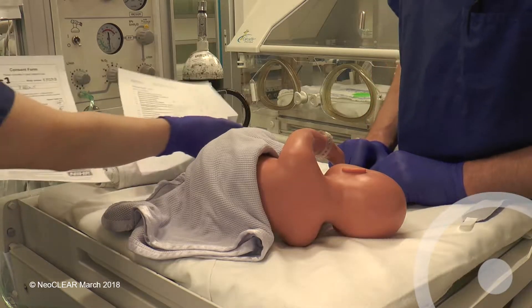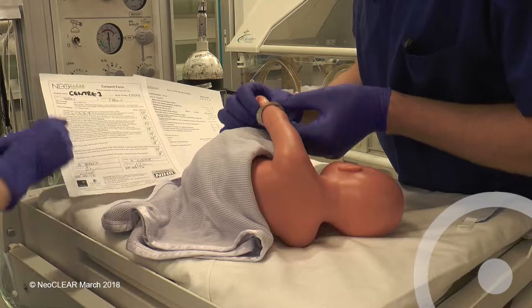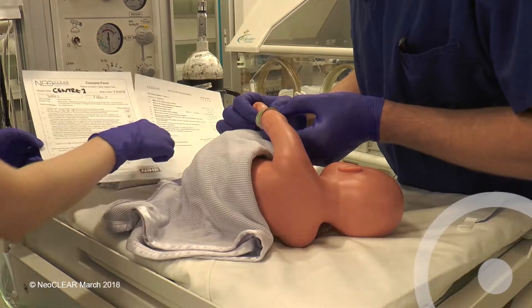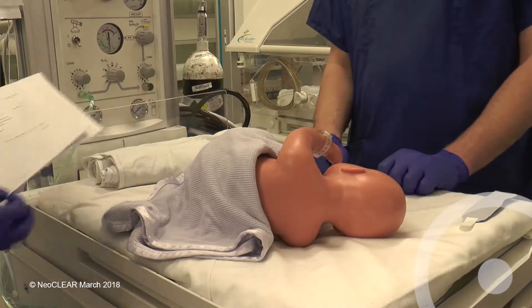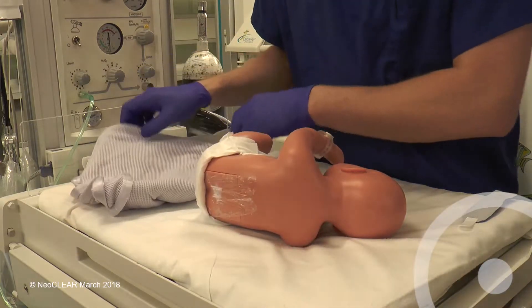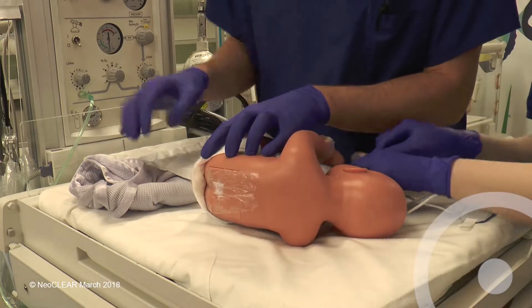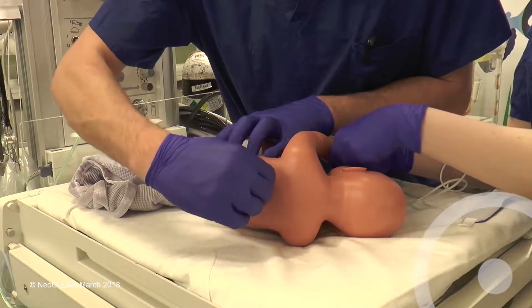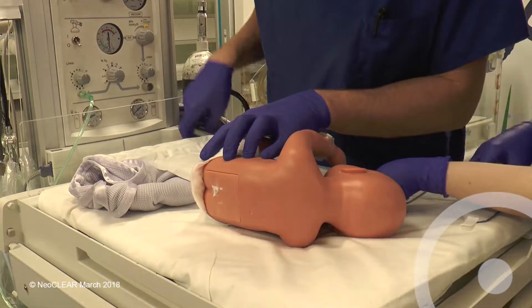Before starting, check the consent form and bring the printed allocation from randomisation. Confirm identity and allocated technique with the assistant. Assistants should wear non-sterile gloves. The area should be warm and well lit. Term babies should have had local anaesthetic cream applied. Remove this and clean any soiled skin with water. Attach the SATS monitor to the right hand and ensure that the trace is adequate.